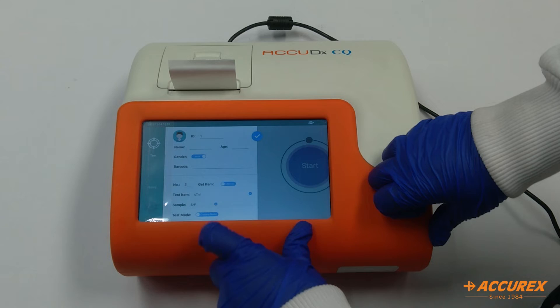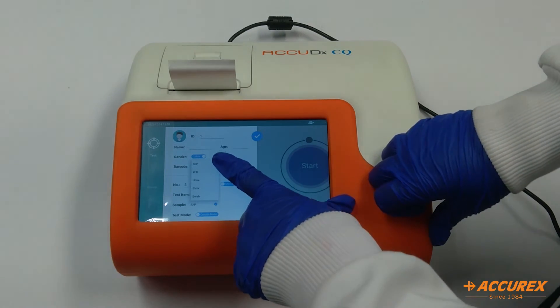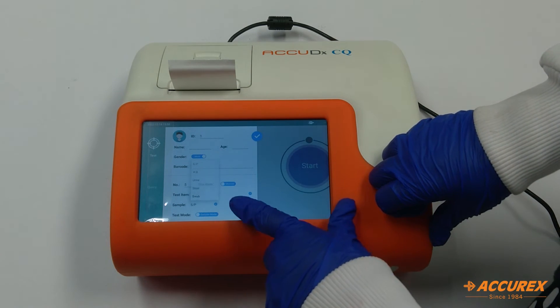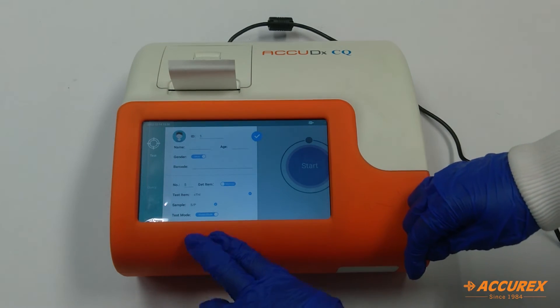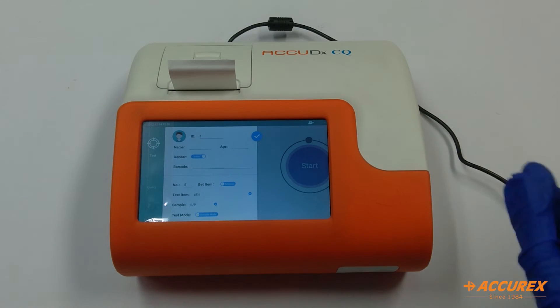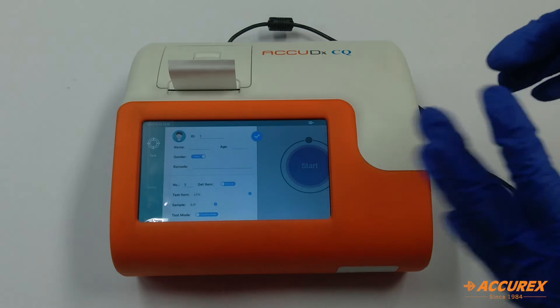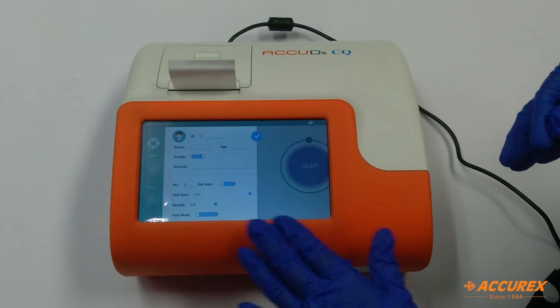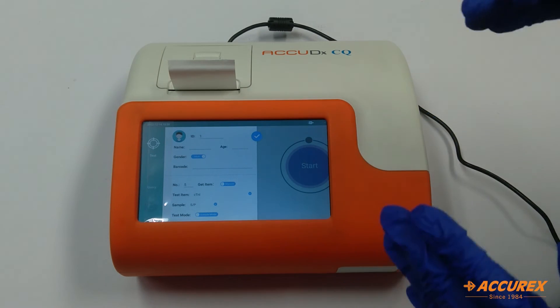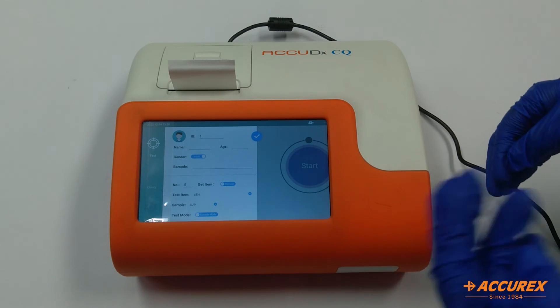Here you select the sample — S or P, which is serum or plasma, whole blood, urine, stool, or swab. Then there is the test mode. There are two test modes: inside mode and outside mode. In inside mode you give the test card and it takes 15 minutes to give results. In outside mode you put the sample in the kit, keep it outside for 15 minutes, then insert it and get the result in two seconds.